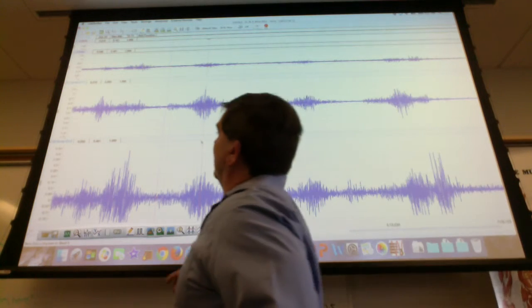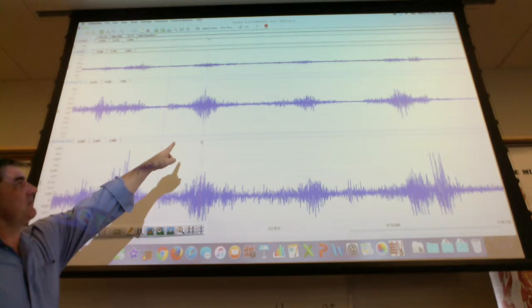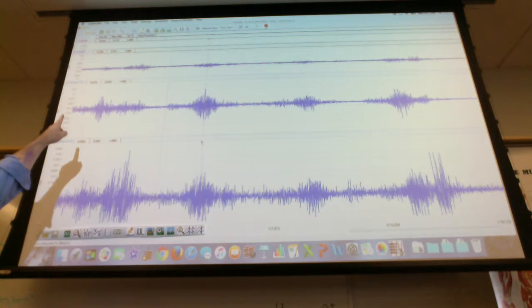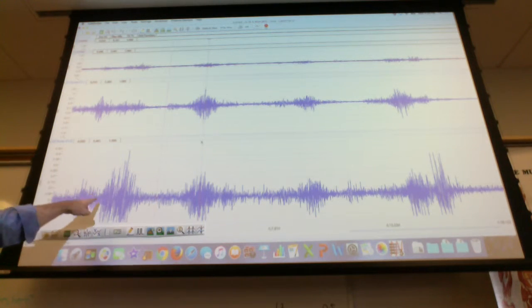Now, that's going to tell me something about those two points. For example, on this top one here, the 0.210, you don't need to pay attention to that first box, but it's telling me the max versus min. That's the voltage here, which is high, minus the voltage here, which is the lower one. So that is 2.255, that peak. That's the millivolts you put for the first one. That's associated with the flexor, or I should say the anterior. So we're doing a flexion.